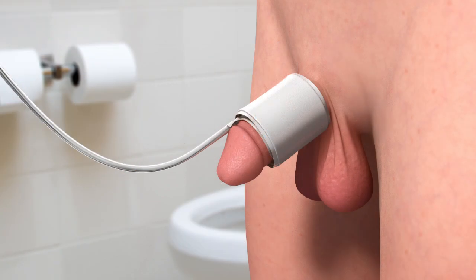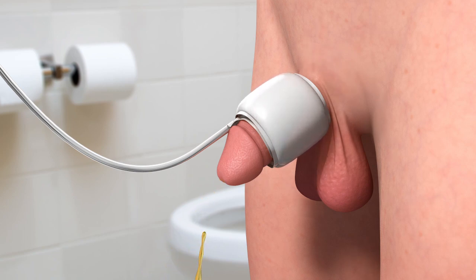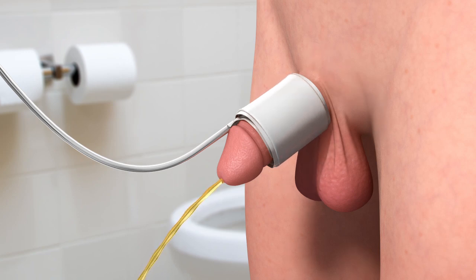To begin the test, the patient is instructed to void naturally into the UroCuff flow meter without straining or pushing. Once urine flow starts, the cuff will slowly inflate until the pressure applied pauses the urine flow. The cuff will then deflate and the urine flow will resume. These inflation-deflation cycles will continue until the void is complete.